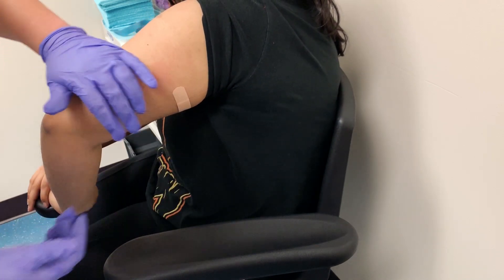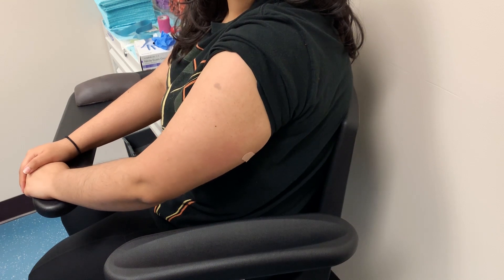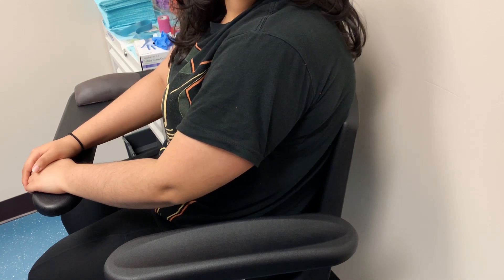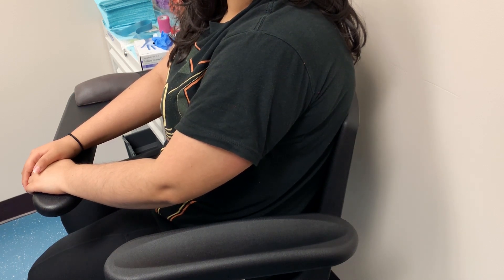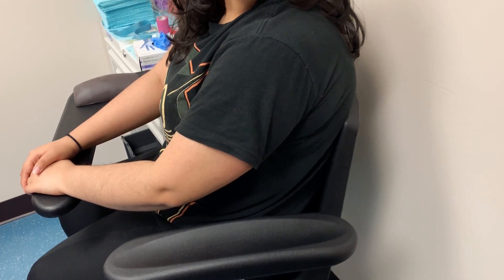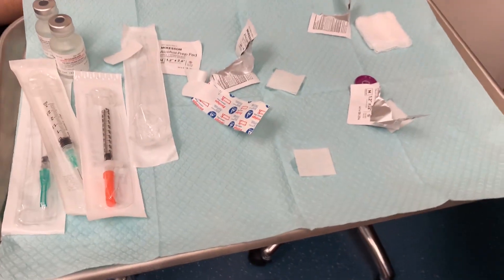Apply a band-aid over the injection site. Here is where you would provide patient education regarding the medication — any literature about adverse effects or anything the patient needs to watch for, especially if they received immunizations. That's pretty much the process; it takes longer to prepare the vaccination than to actually give it. Once you're done, just clean up, and if you have any questions, let me know.